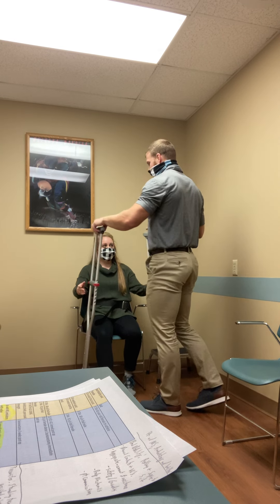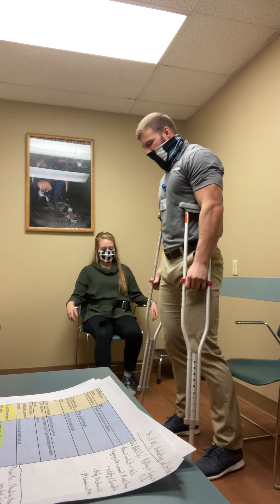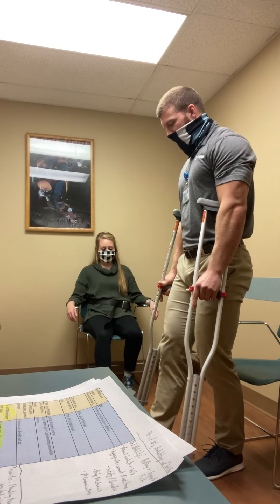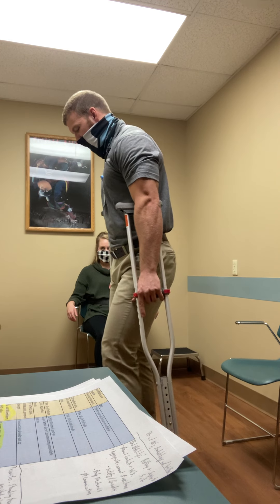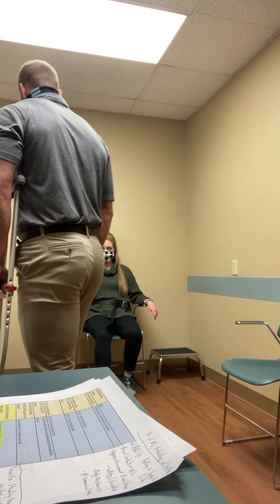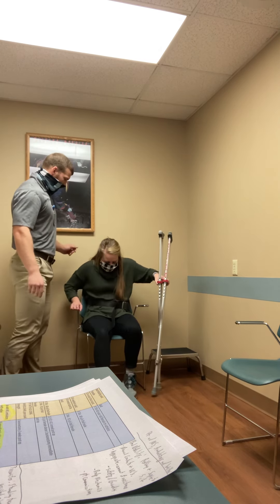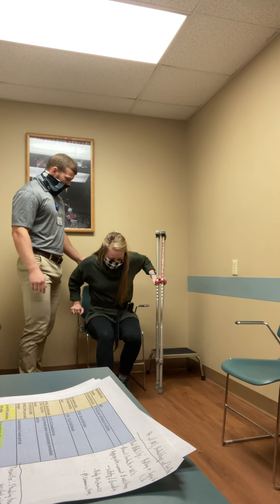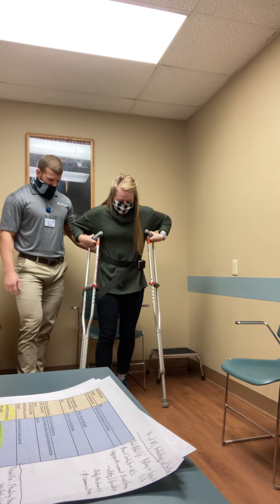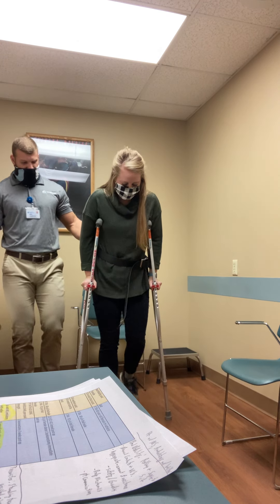We're also going to go through a step-through gait pattern when you start feeling a lot more comfortable. Same concept where the foot and the crutches are connected — we're stepping, but then with that left leg, we're going to step through. Step in, stepping through. Let's go one last time: step in, stepping through.